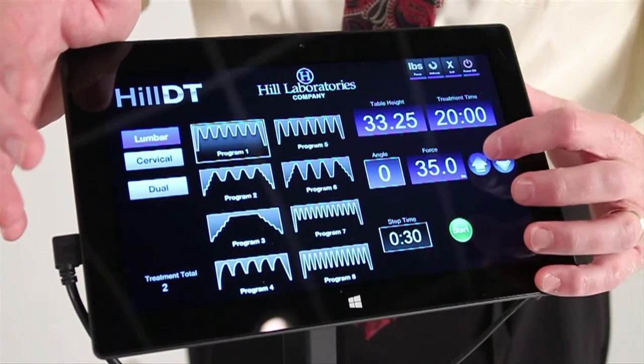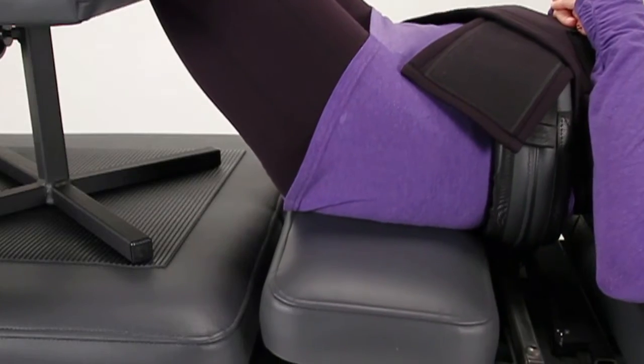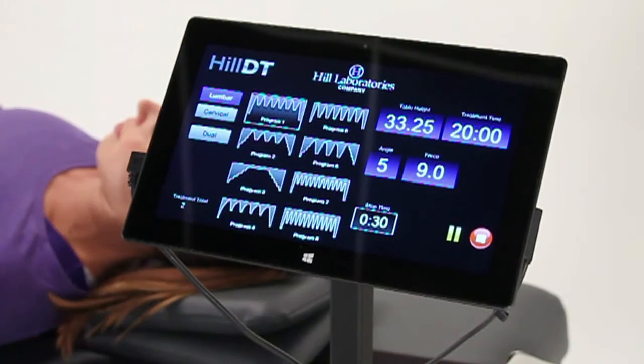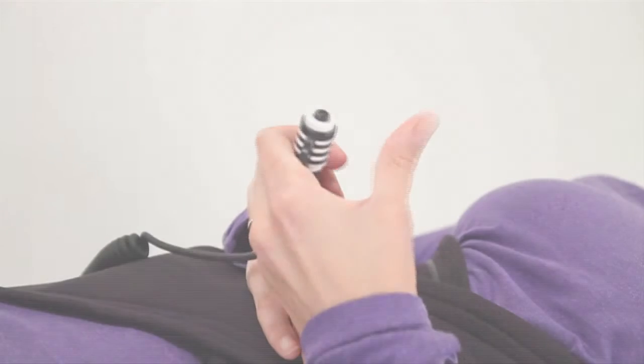Set the pelvic tilt to target the exact disc with carefully calculated force. When ready, press start to begin the treatment. If at any time a patient experiences discomfort, they can press the handheld treatment interrupt switch to immediately stop the treatment.